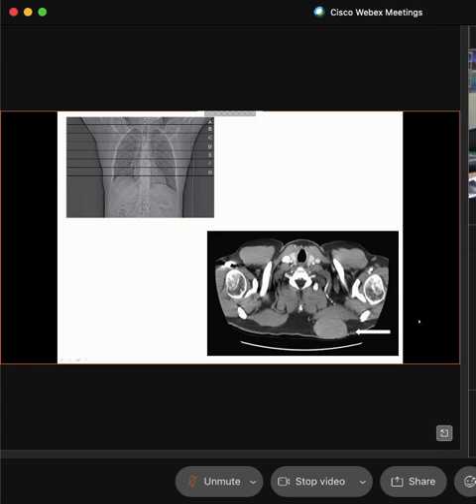Is that radio opaque? It's radio opaque. So what is radio opaque in our bodies? Can absorb it. But what kind of anatomy do we have in our bodies that's radio opaque? Mainly bone. So we know that this is bone.